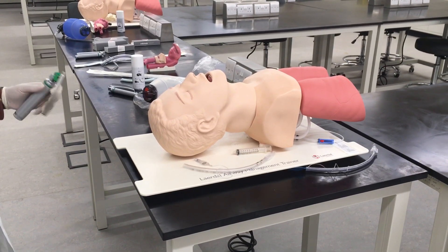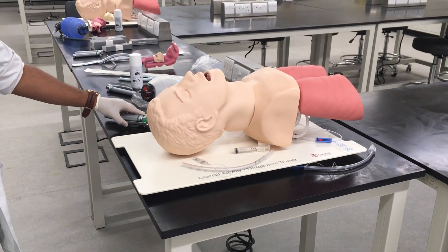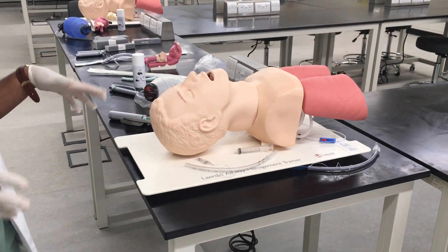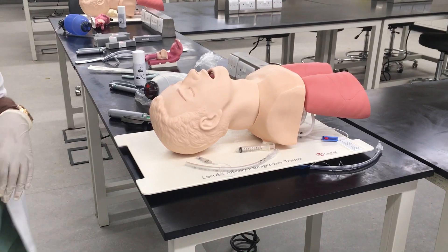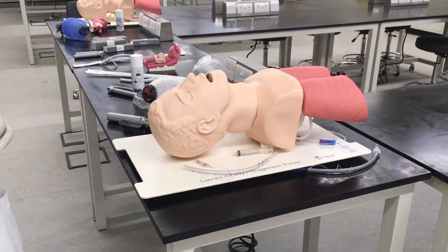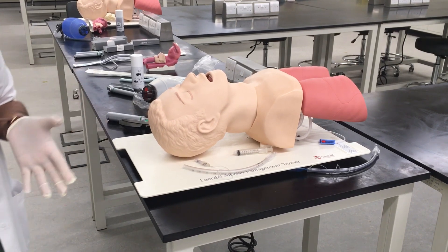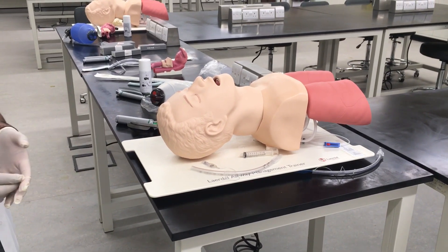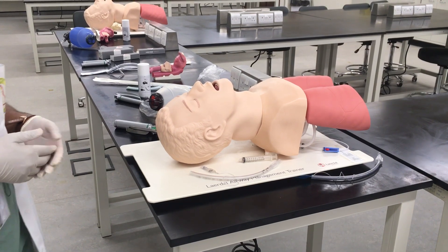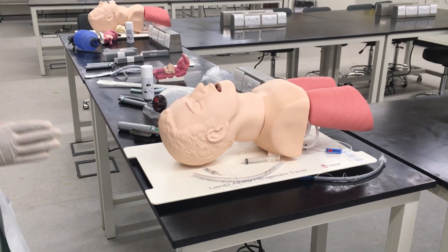Make sure that you assess the airway. The airway assessment is comprised of several things — you need to focus on the difficult-to-ventilate and difficult-to-intubate predictors. For difficult to ventilate, you can mention the BONES mnemonic: beard, obesity, and so on.